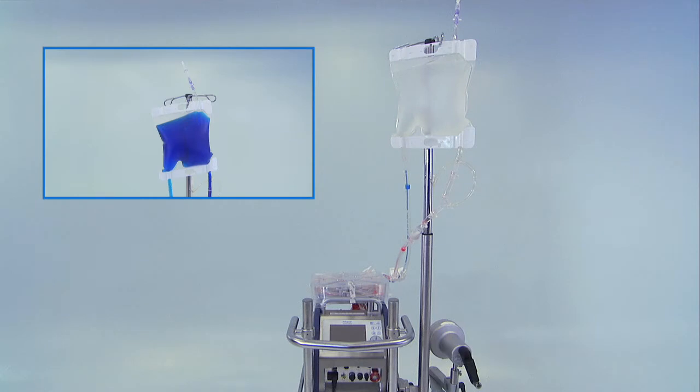For the purposes of illustration, we have colored the priming fluid blue in the following film sequences.